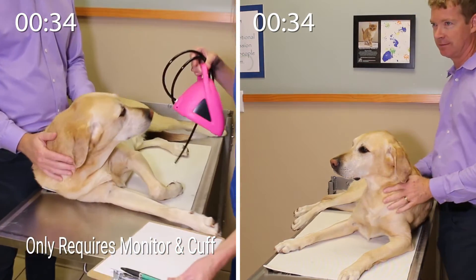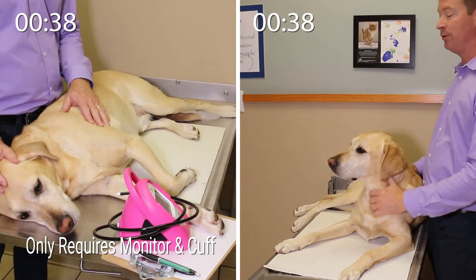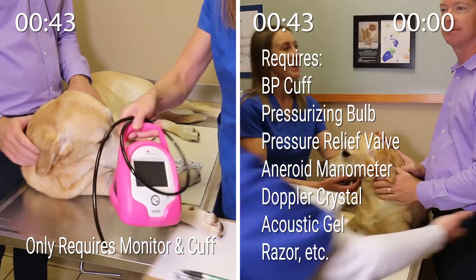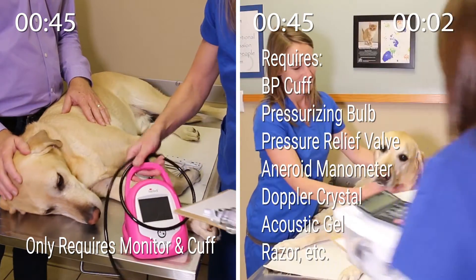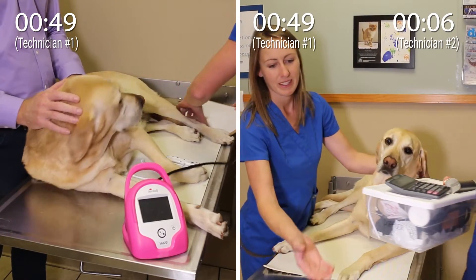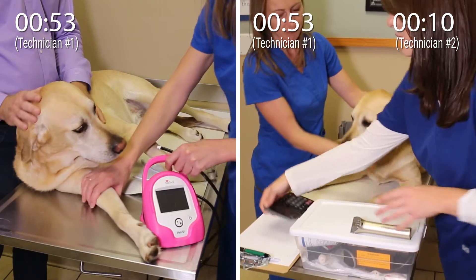Each blood pressure method requires specific equipment and setup. The Doppler method requires a blood pressure cuff, pressurizing bulb, pressure relief valve, aneroid manometer, Doppler crystal, acoustic gel, razor, and headphones. The oscillometric method requires an automated blood pressure monitor and a blood pressure cuff.